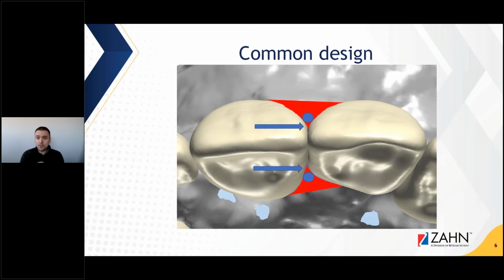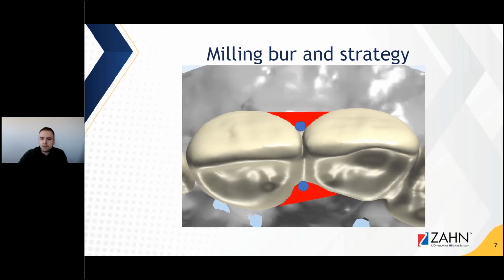We were able to measure that it shortens calculation time if we have a better connector designed. Here we have an example of a connector that's a little wider and a little more rounded. And so what happens is the burr is actually able to float easily back and forth without having to reach that particular area. And it's exactly the same thing on the lingual as well. And so that really helps with overall design.